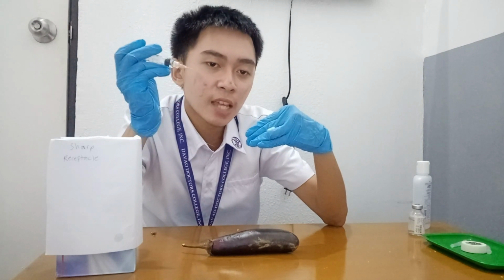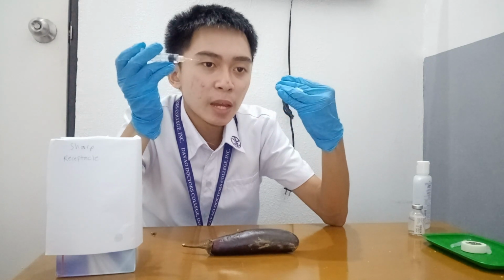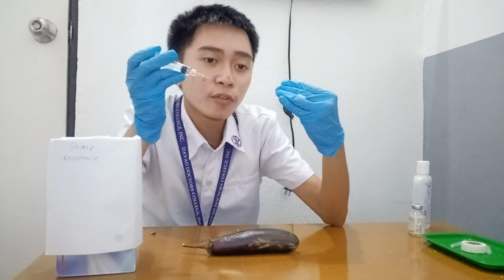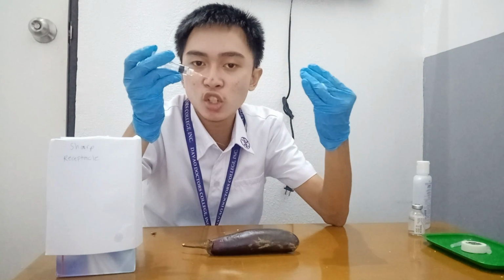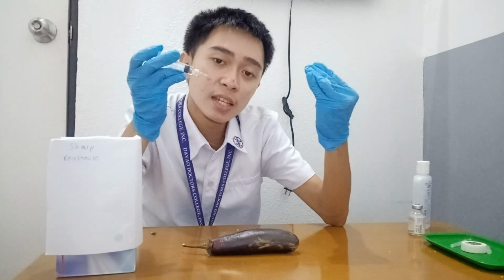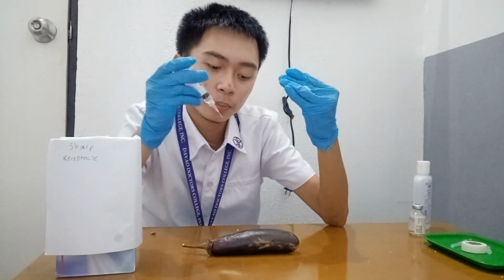Hold the barrel of the syringe steady with your non-dominant hand and aspirate by pulling back the plunger with the dominant hand. Aspirate for 5 to 10 seconds. If blood appears in the syringe, withdraw the needle, discard the syringe, and prepare a new injection. If blood does not appear, inject the medication steadily and slowly, approximately 10 seconds per mL.